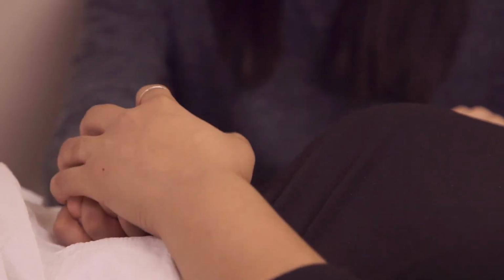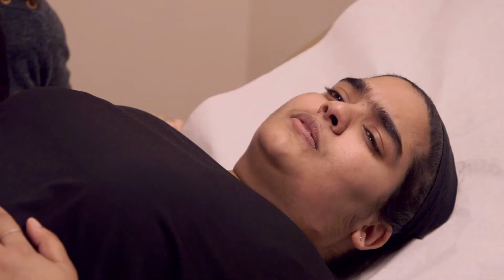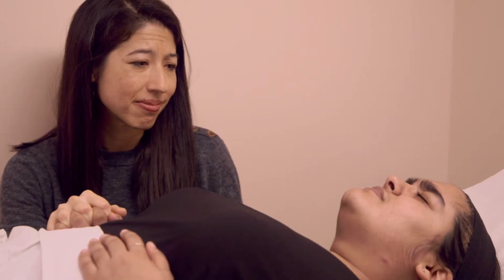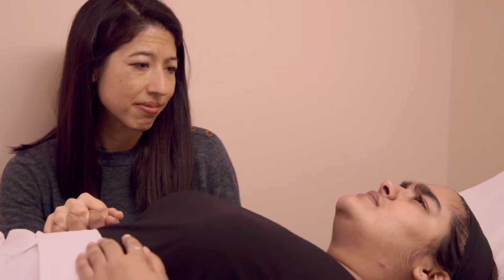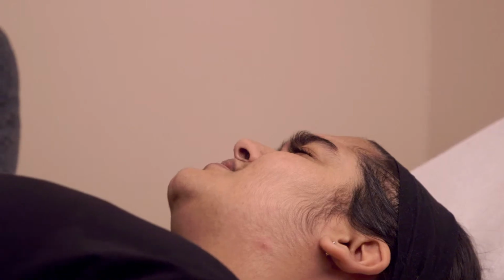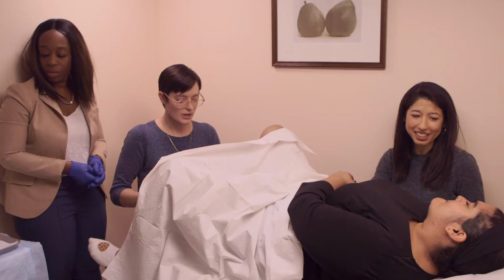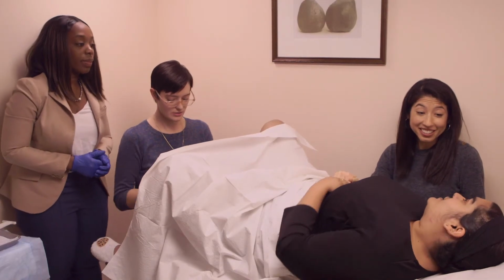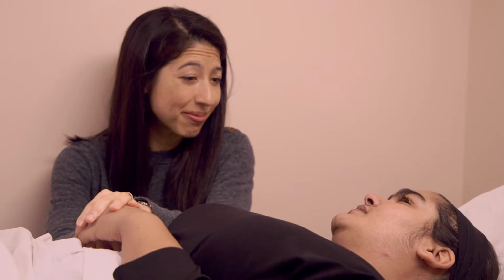Okay, this last part should take about 1 to 2 more minutes. You'll feel a little bit more cramping as your uterus is getting smaller. This is the pregnancy coming out. Just take some deep breaths in and out. Okay, so your abortion is done. Everything went well. That means you're no longer pregnant. Really? It's over? It's over. That was way quicker than I thought it would be. That was super fast. Yeah, it's a very quick procedure.